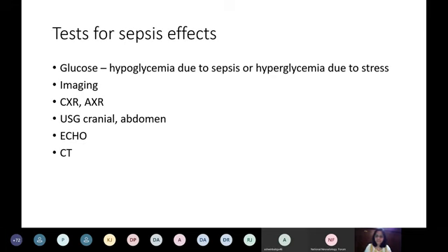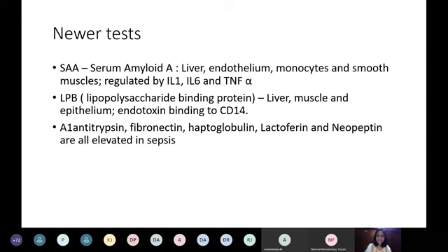So even myocarditis, we can look at the function of the baby, the function of the cardiac muscle. So in current corona, viral myocarditis might be the presentation in the newborns. If they're getting very sick, very rapidly kind of collapsing, we should always think of viral myocarditis when there is no RDS, no other reasons for doing that. So echo would be useful there. CT also is useful, but as a last resort if you don't get any answer. So imaging also plays a part in sepsis.